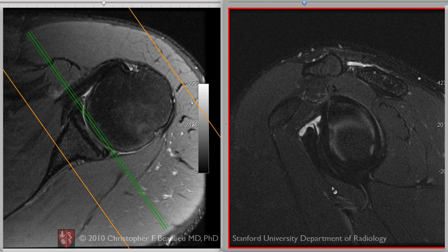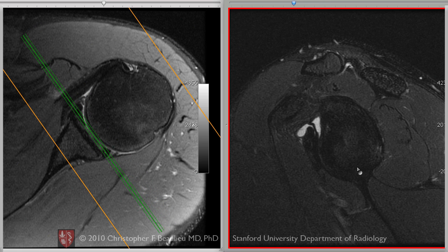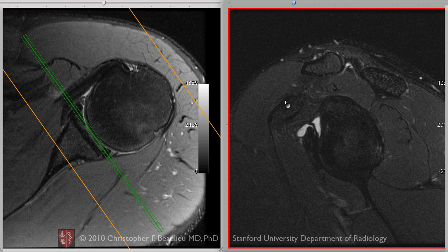This is important because the conventional clock face approach to the glenoid is that 12 o'clock is the superior position, and then anterior is going to be the 1, 2, 3 o'clock position, 6 o'clock, 9 o'clock, and 12 o'clock. The convention being that the coracoid is always anterior, and the coracoid is always the 1, 2, or 3 o'clock position.